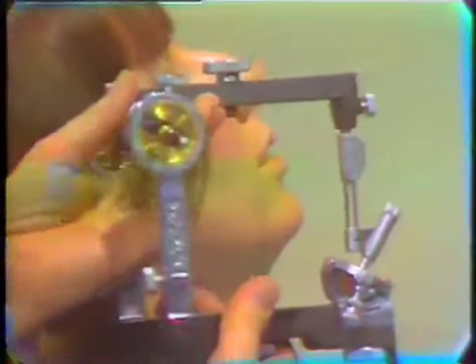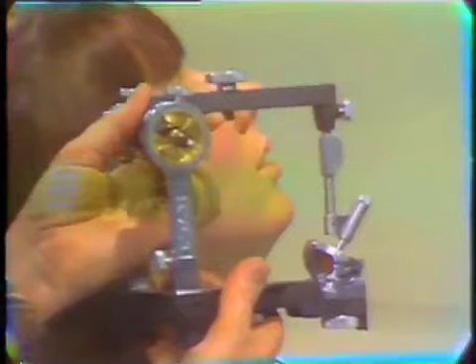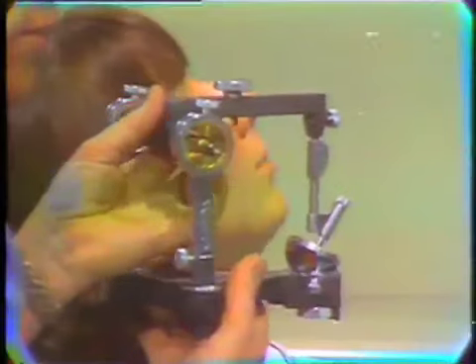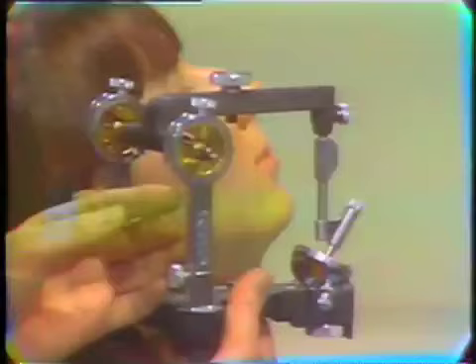We find that the patient can make a hinge movement as we demonstrate here, and the dental articulator can make a hinge movement. What we would like to do in the transfer of cast from the patient to the articulator is to wind up with the same axis so that the teeth, when they're closed, close the same on the articulator as they do in the patient's mouth.